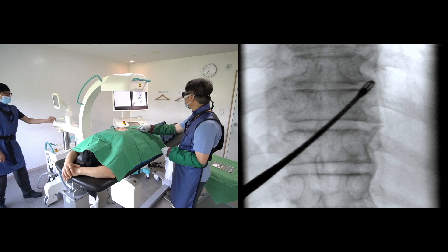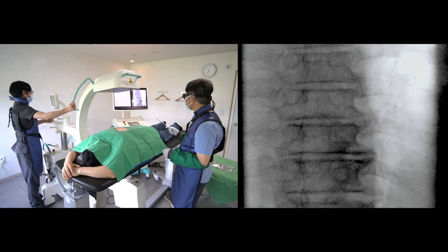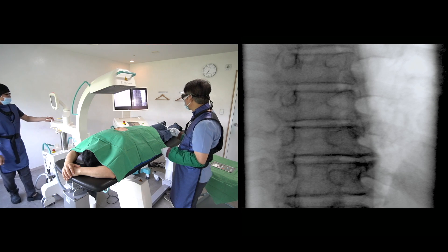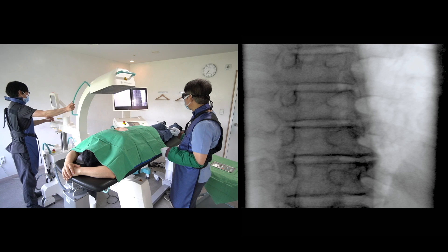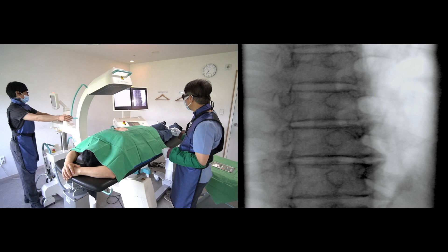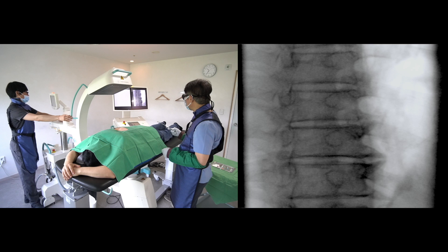The alignment of the inferior end plate of T9 looks good on AP view, so I'm going to rotate to the right ipsilateral oblique position. Usually I rotate the C-arm until I can find the target and the suitable needle pathway. The transforaminal approach is more difficult in the thoracic spine compared to the lumbar and cervical spine.